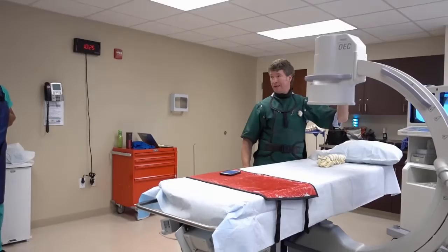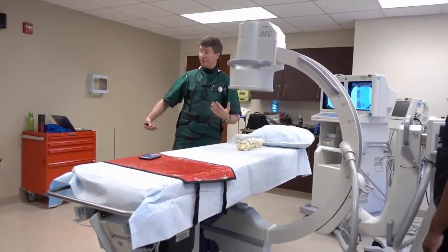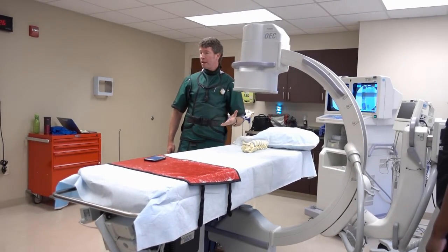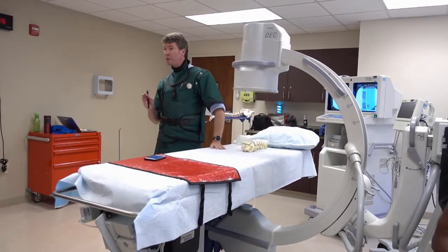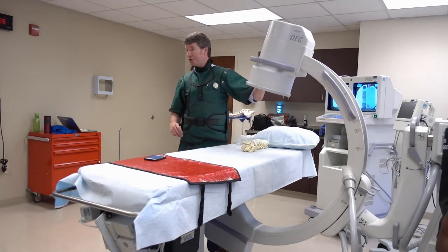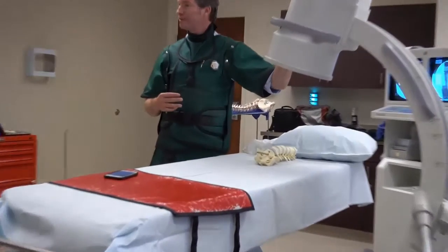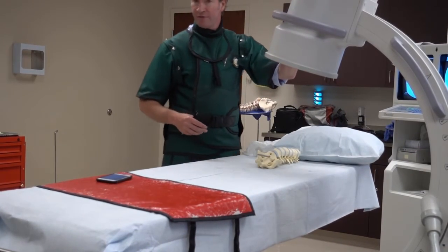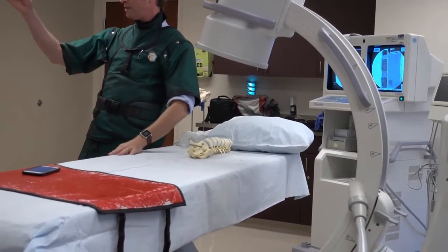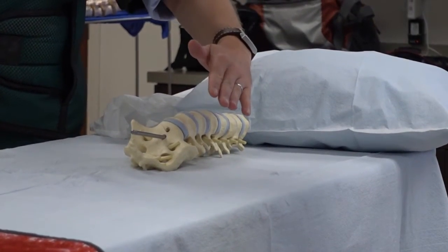And we never really deviate, at least here, from the AP. It's not necessary. And the same thing is if we come from the buttock and go through the buttock musculature to the hip, AP is best. The reason we like AP is because if we always use AP, we know that we're never going to project the nerve or artery over the hip, over where we're headed. If it varies, and you're not used to it varying, then because of that parallax, remember this, all of a sudden the nerve and the artery project right over there, and when we pass the needle down, we can go through one of those things.